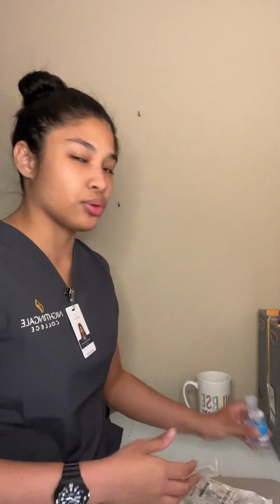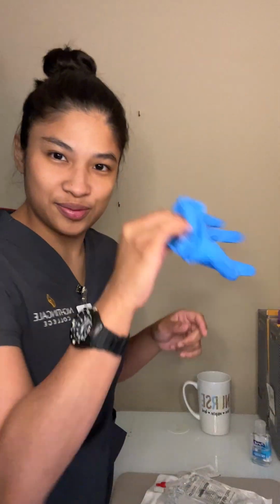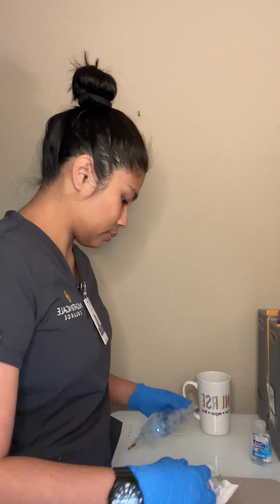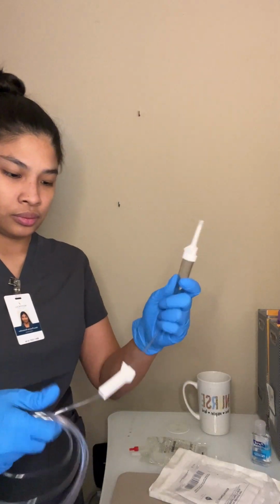Let's start. You'd want to perform hand hygiene and provide privacy. I will don gloves. I will also be going through the parts of the IV tubing. So this is the primary line, which has a spike.